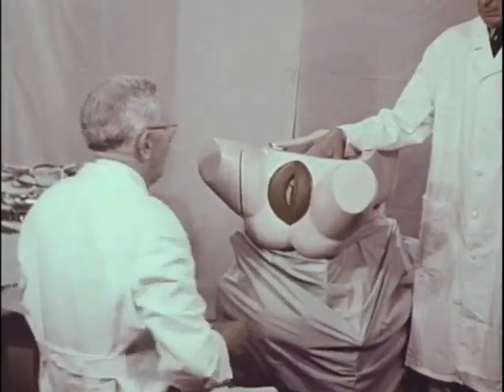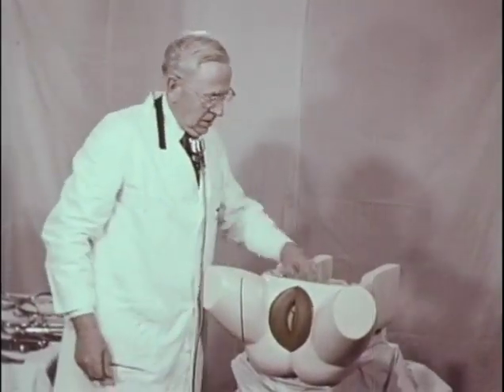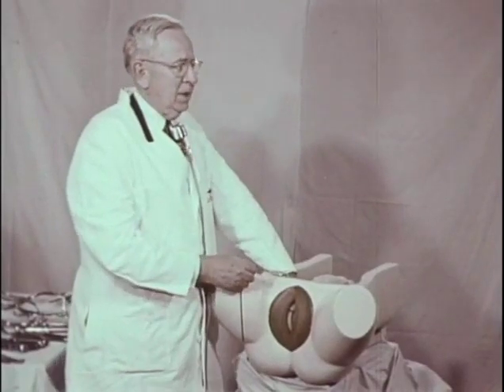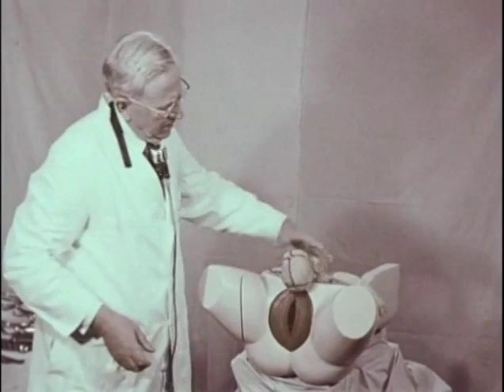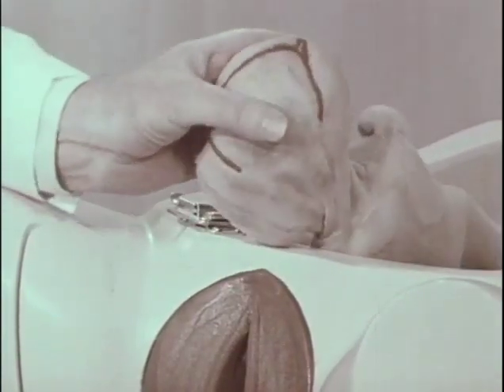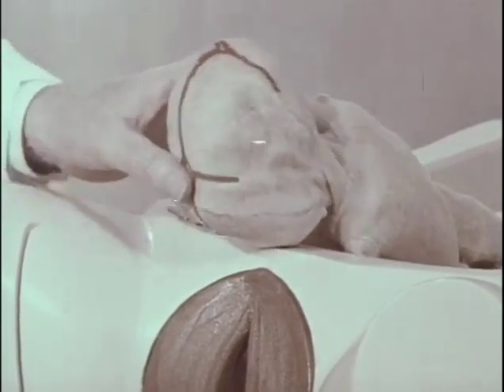The next maneuver will be the Scanzoni maneuver. And the choice of instrument is the solid blade Elliott type, the Tucker-McLean forceps. In the Scanzoni maneuver, there is a complete instrumental rotation with a single maneuver, but requiring a double application of the forceps.